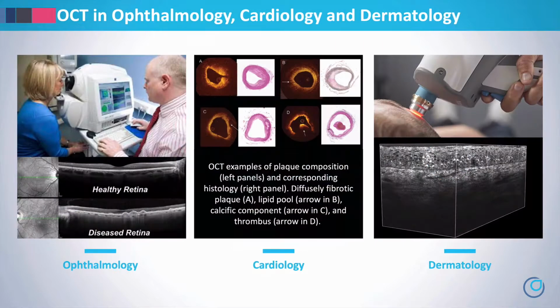This figure shows some of the other areas of application of OCT. Ophthalmology has widely used OCT, basically to look at the retina. You can see the advantage of this application. Once again, very high resolution, looking at small tissue interfaces in a detailed fashion with enhanced diagnostic capability.